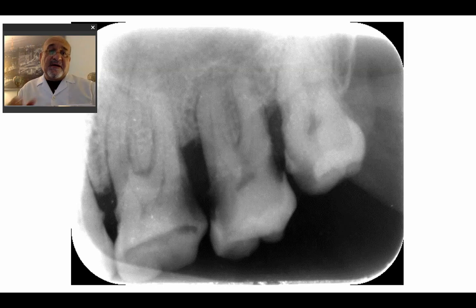I think with this slide we're done. We have finished the anatomical landmarks seen in the maxilla, and in the next session we will talk about the anatomical landmarks of the mandible. So what we have discussed here is the appearance of bone, appearance of soft tissues that cast a shadow on the images of teeth, air shadows, remember the lip shadow, nostrils and the ala of the nose, these are all soft tissues, plus other structures that would demarcate the appearance.